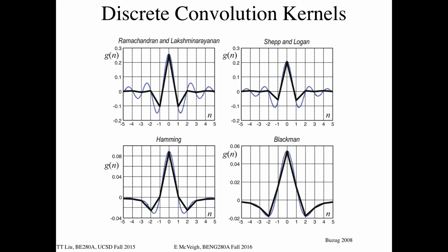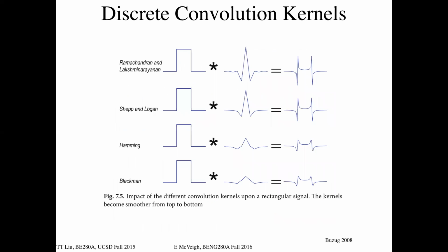A 512 Fourier transform would take tens of seconds, so you really needed to make things efficient. You could even hardwire convolution, making chips that just did convolution, and then chips that did back projection directly, and those went into the scanners. Nowadays it doesn't matter. You can do whatever you want, because you have infinite speed compared to those old days.